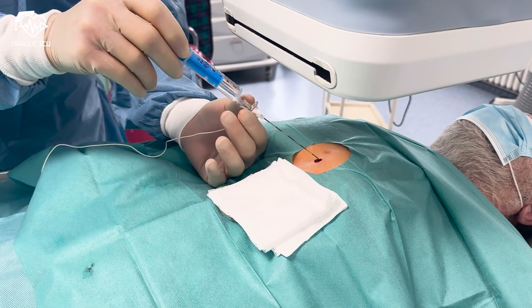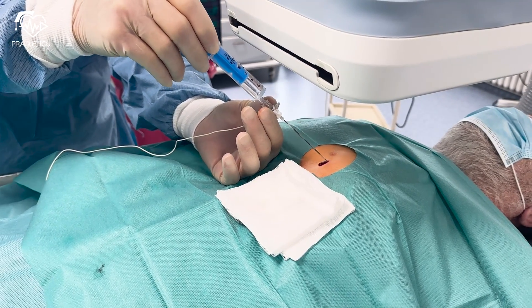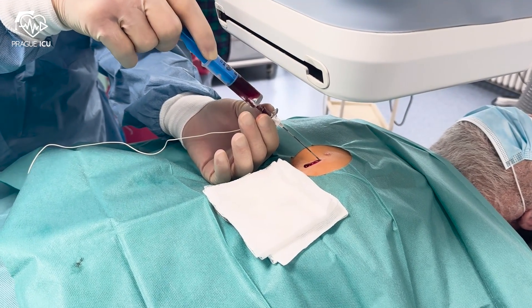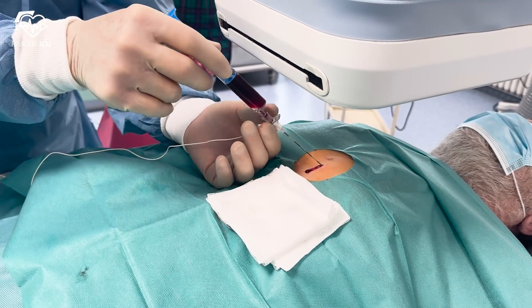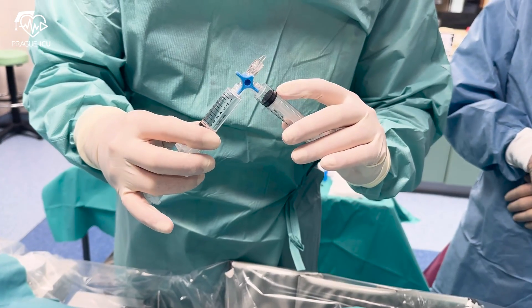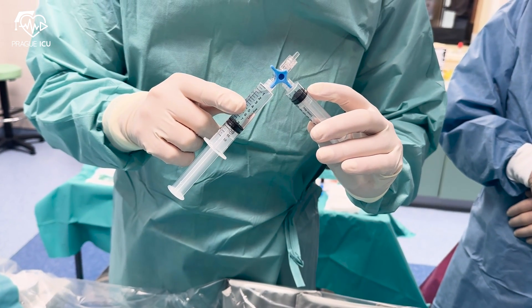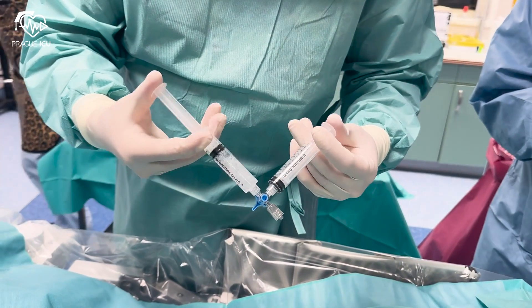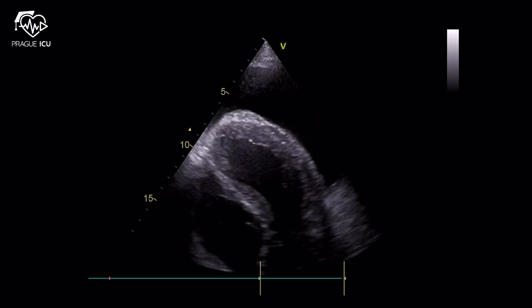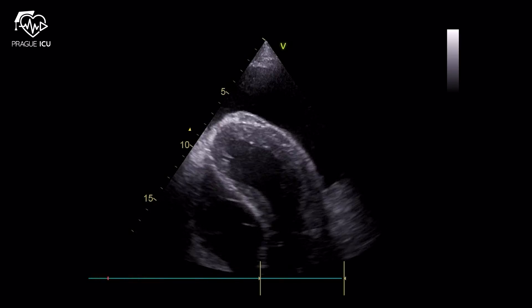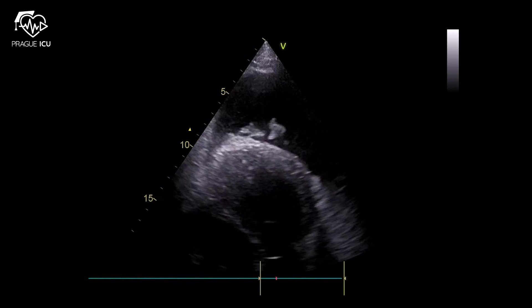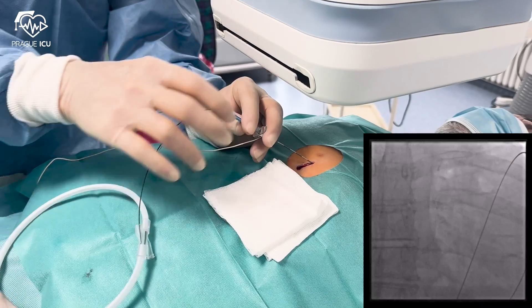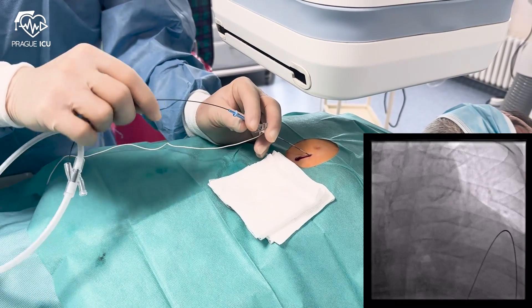Continue inserting the needle with negative back pressure until pericardial fluid is aspirated. A bloody aspirate may indicate myocardial puncture or hemorrhagic pericardial effusion. Therefore, the extracardiac position of the tip of the needle can be confirmed by injecting agitated saline through the Tuohy needle — the bubbles can be visualized through echocardiography in the pericardial space, creating a nice snowflake-like image.